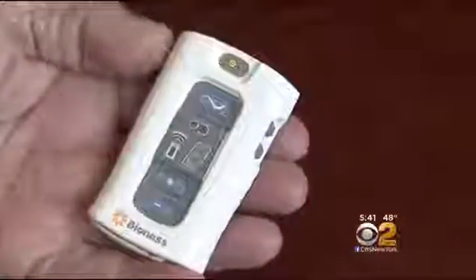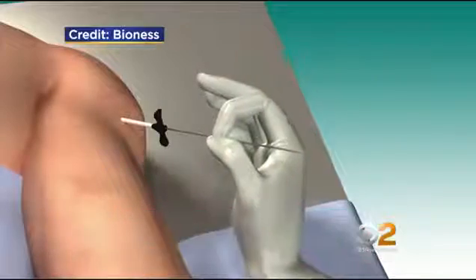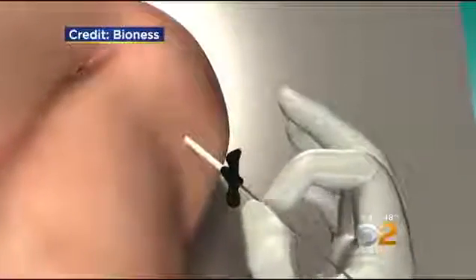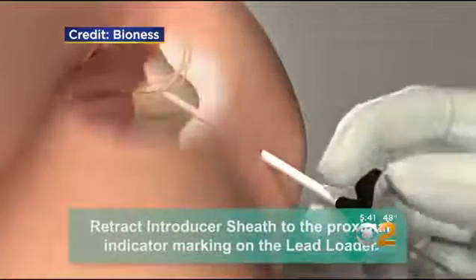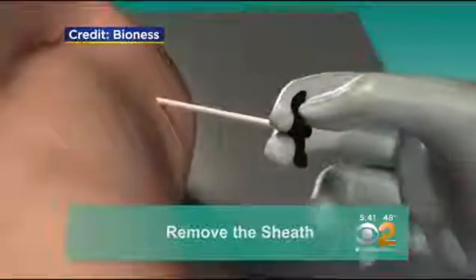Not just phantom limb, but all sorts of pain. Pain often comes from hyperexcitable nerve fibers that are easy to fire. So by taking that away and making the nerve fire more normally, we're able to block a lot of the pain. Unlike other electrical pain blockers, this device isn't inserted into the spinal column. It's placed directly on a peripheral nerve in a 15-minute procedure under local anesthesia.